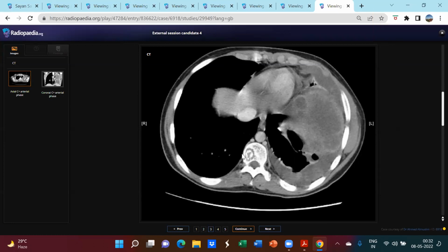Yeah. So ultrasound guided biopsy for a lung lesion is not that common. It can be done, as you told, but there is a very high risk of pneumothorax as you'll go in blind with an ultrasound probe, and you'll have to target a peripheral lesion. Ultrasound, you can never target a central lesion. Okay, never say a central lesion.